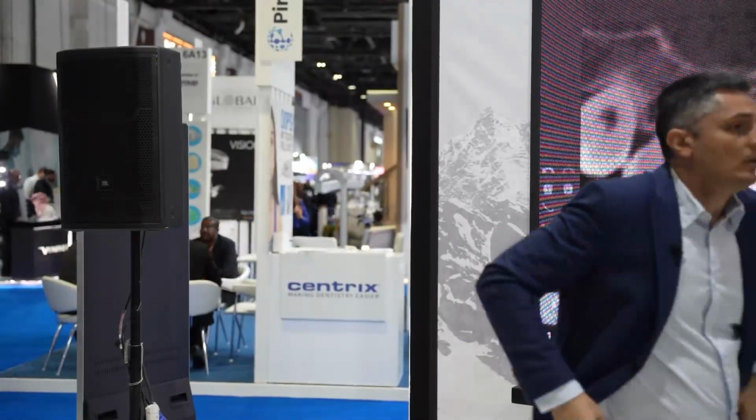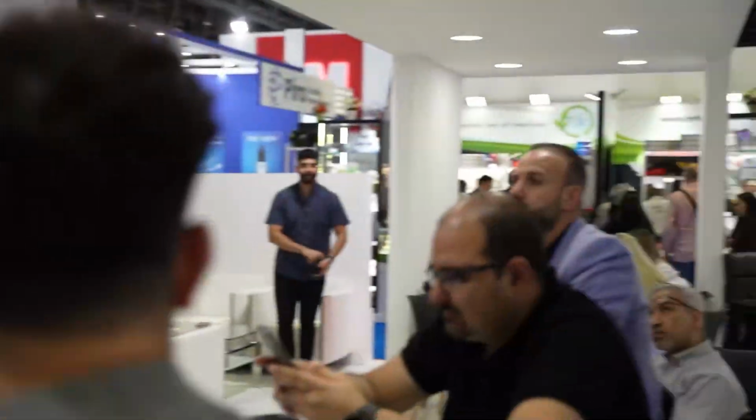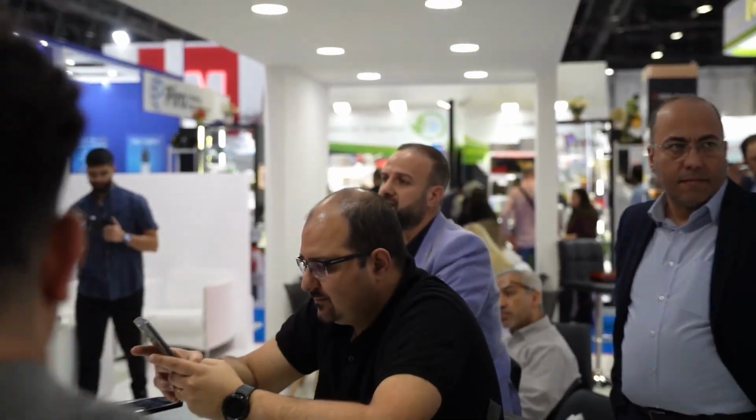There is a limitation in your technique, because when you have like 7 millimeters, you cannot go 1.5 millimeters more. For cases where you have like 7 millimeters over the nerve, for sure I will drill not more than 7 millimeters. I have to be sure about that. But I will release the implant from the crest, so I will use the cortical drill, even at 7 millimeters.